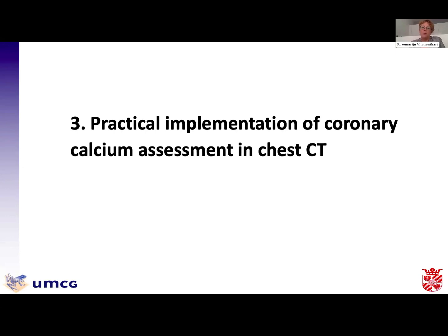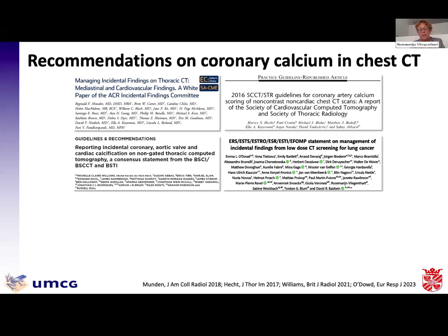So how should we go about practically implementing coronary calcium assessment in chest CT? By now we have 4 different documents that give recommendations on coronary calcium in chest CT. The latest one, and the only one really that is focused on the use in lung cancer screening CT, is the right lower one. It's a multi-society statement, including ERS, etc., on the management of all incidental findings in lung cancer screening CT, including coronary calcium. And actually, the recommendations are very similar.